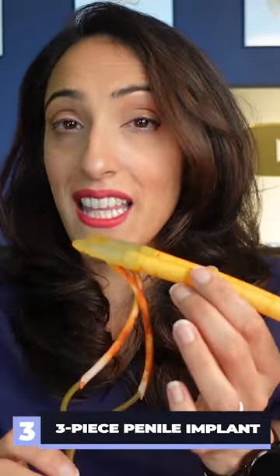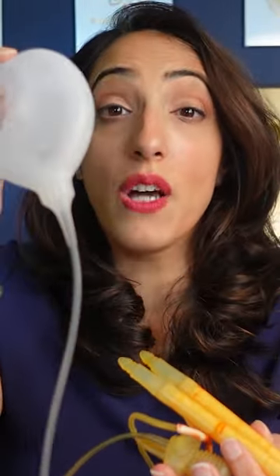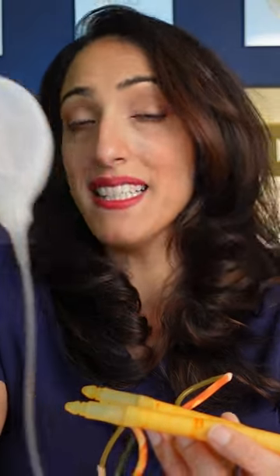The last option is a three-piece device. The cylinders are implanted into the penis, a pump goes into the scrotum, and a reservoir is placed in the lower abdomen. This reservoir contains a large volume of fluid that can move between the cylinders and back, allowing the penis to become completely flaccid.